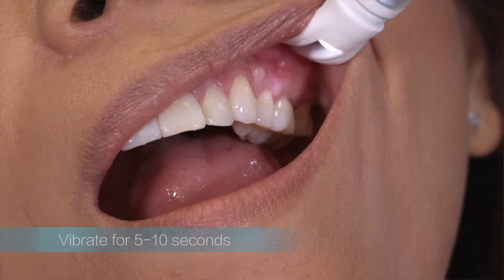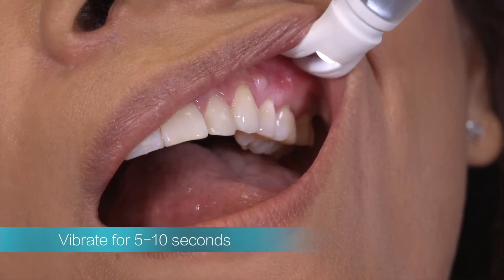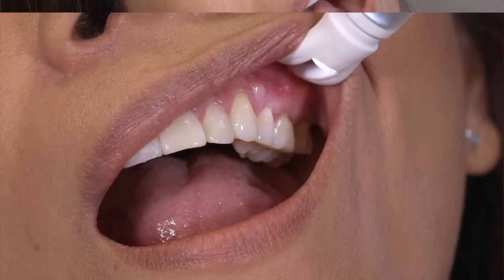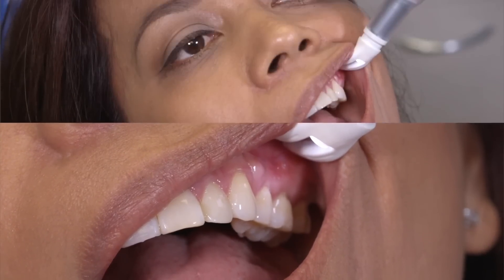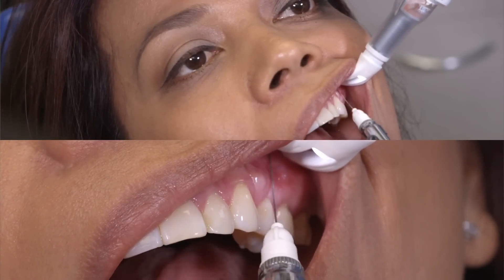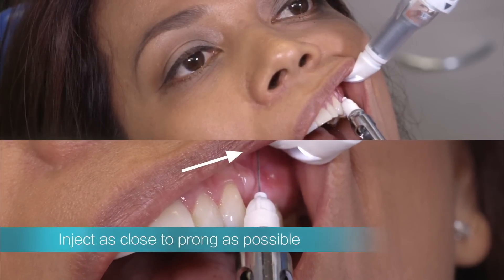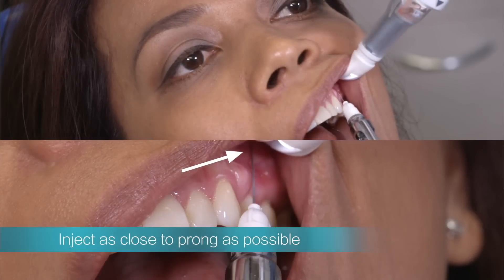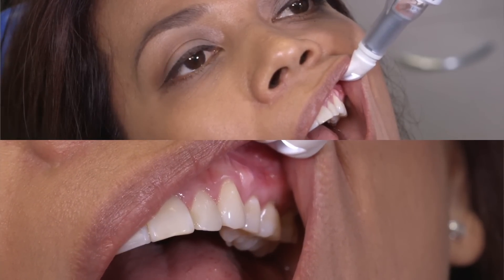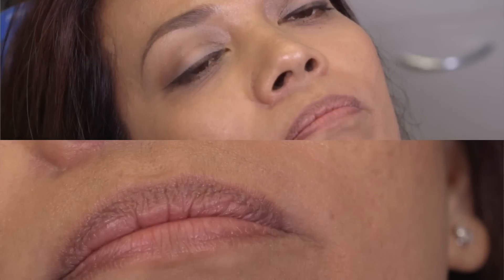Retract the lip and vibrate for a range of 5 to 10 seconds to activate sensory receptors. While simultaneously vibrating, slowly inject local anesthetic. Remove the needle and vibrate for a few seconds to help dissipate the solution and remove the device.